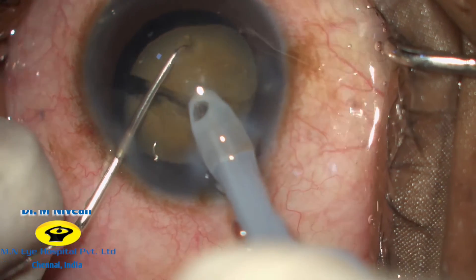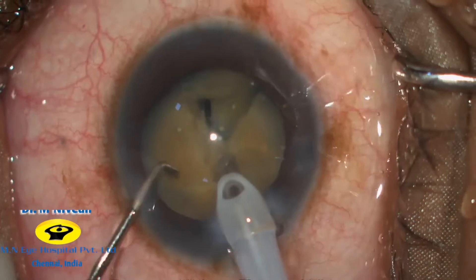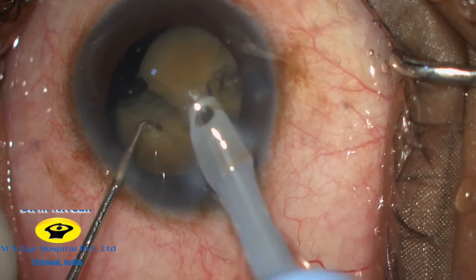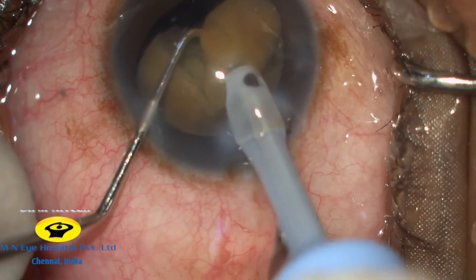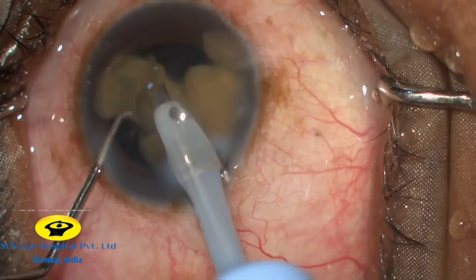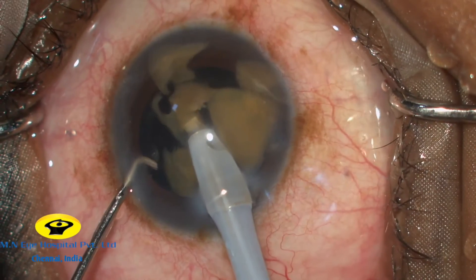The same technique is employed on the other heminucleus. The previously separated nucleus is again cracked into two halves. FACO emulsification is now commenced and the nucleus is broken down into smaller fragments and emulsified.